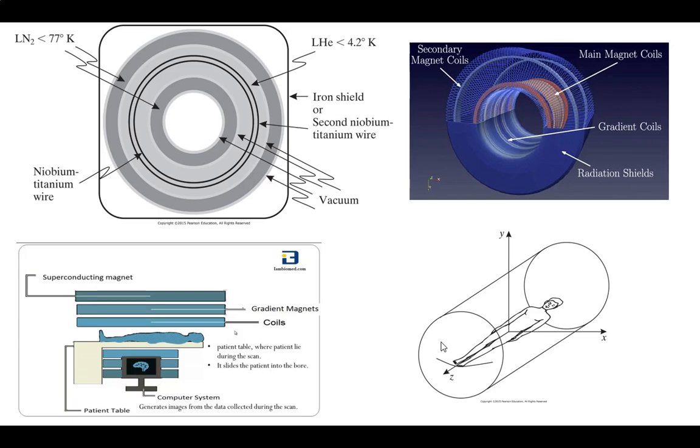Right? So we've got the magnet, the gradient magnets, and the coils. Coils are RF coils. If you ever see the word coil, you know it's only dealing with those, even though everything is a coil. This is another one of those nomenclature issues rather than a physical reality, but these magnets are actually coils, as are those ones.